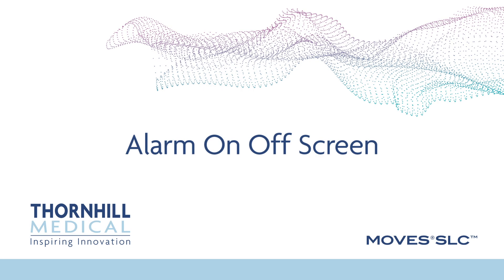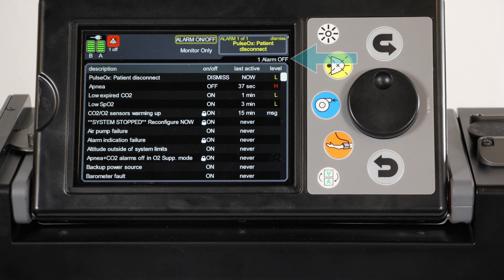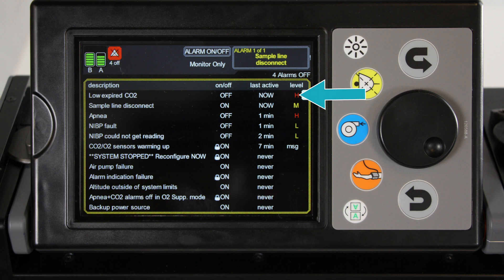Alarm on off screen. Alarms can be enabled or disabled through the alarm on off screen. A summary of the alarms turned off is shown at the top right of the screen. If no alarms are turned off, the phrase 'all alarms on' is displayed. When an alarm has been turned off, the screen will display 'one alarm off.' Alarm level is indicated at the right of the alarm on off screen: a red H indicates a high priority alarm, a yellow M indicates a medium priority alarm, a yellow L indicates a low priority alarm, and the letters MSG denote a message, not an alarm.